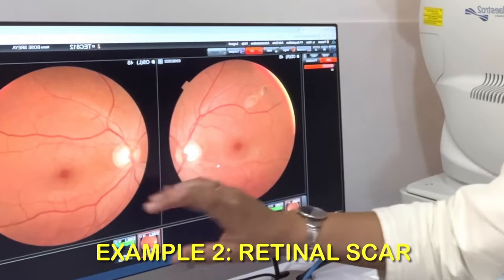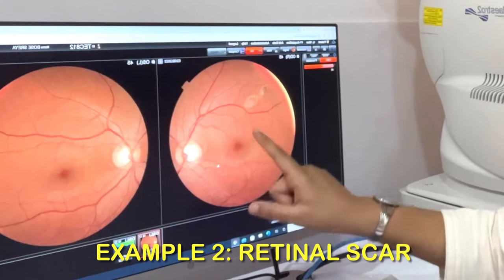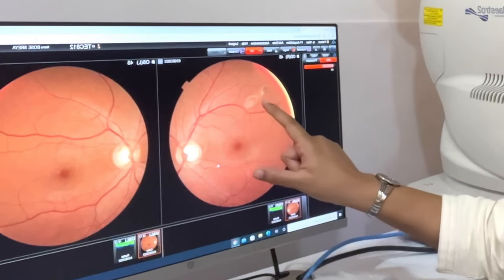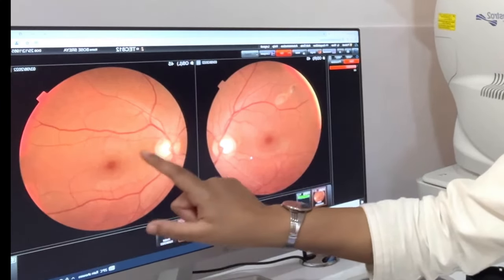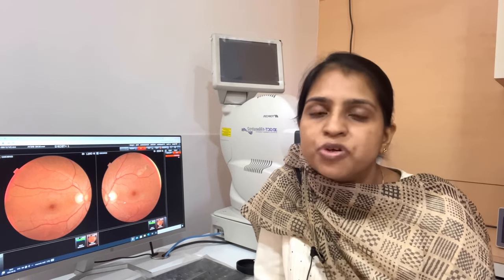Here you can see a scar — this scar is not in this eye. We know that there is a scar from the photo we have taken. So if we don't have any documentation, if we don't have any report, next time we won't remember where the scar was.